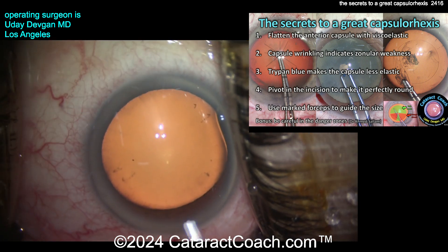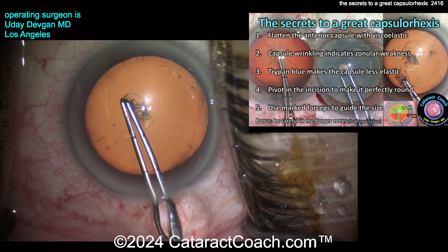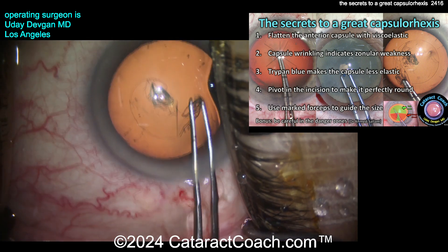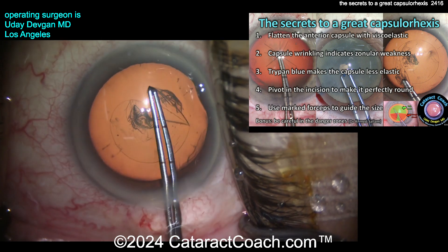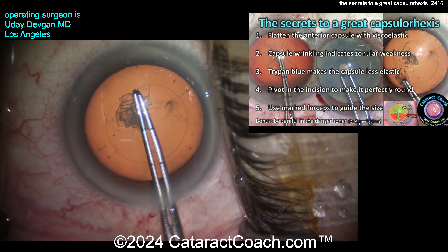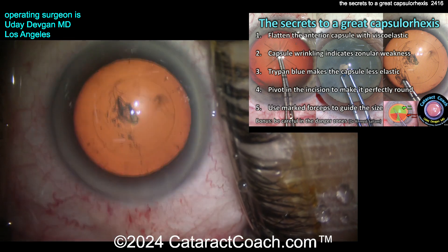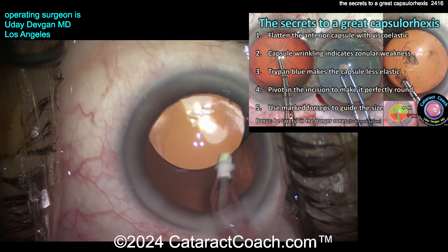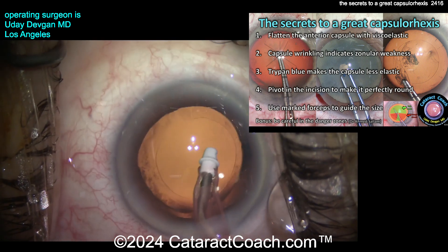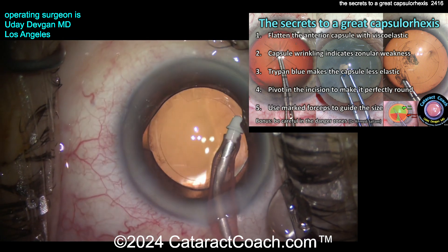Here is a routine case — everything looks normal. We flatten the anterior lens capsule with viscoelastic and we're going to do our capsulorrhexis with just forceps. Going in with the forceps, I first measure to get an idea of what I want to do. As I tear it, I'm really doing a good pivot in the incision to get a beautifully round rhexis. Look how round that is — beautifully done. Taking my time, getting a nice round rhexis — exactly five millimeters. Fast-forwarding to the end of the case, look at the optic beautifully overlapped by the capsulorrhexis: a six millimeter optic, a five millimeter rhexis. Exactly the way you want it.